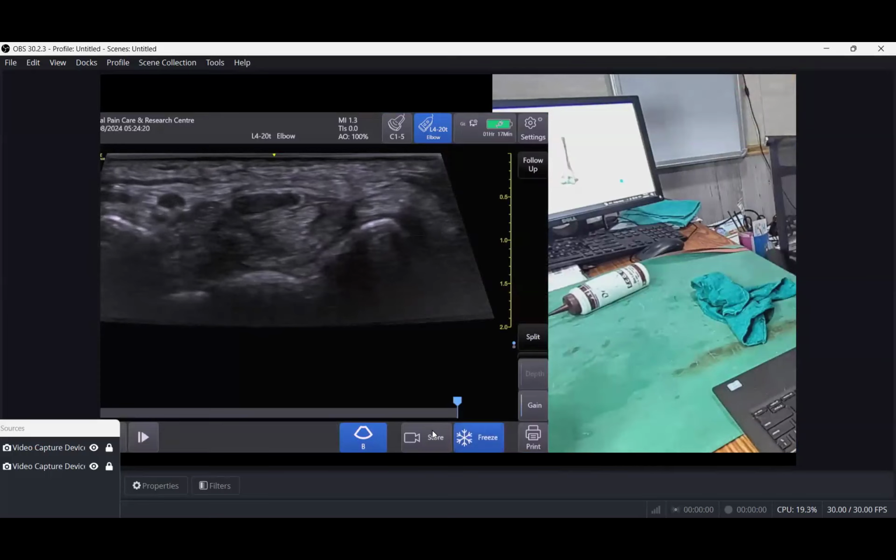So here you can very nicely see this one is the ulnar artery. This must be the pisiform, and this one is the scaphoid. From the scaphoid, you can see an arch-like structure extending like this. This one is the flexor retinaculum, and it basically divides like this. Here you can see this one is the median nerve, and all these other structures are basically the tendons. There are 9 tendons. These are the median nerve.